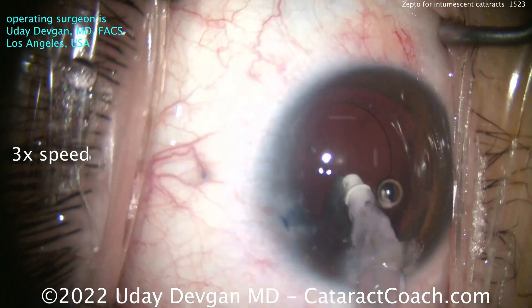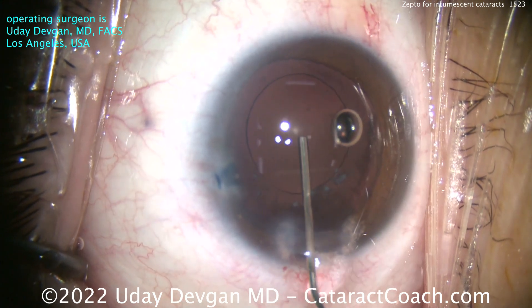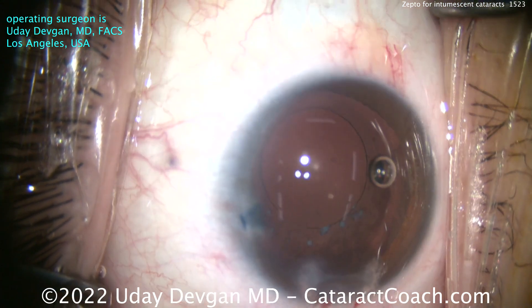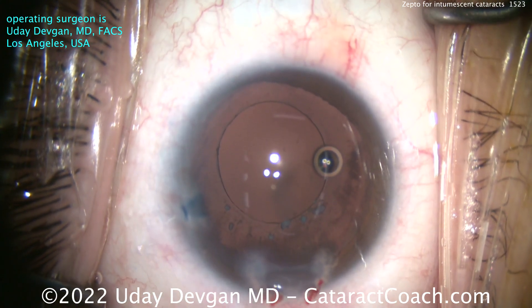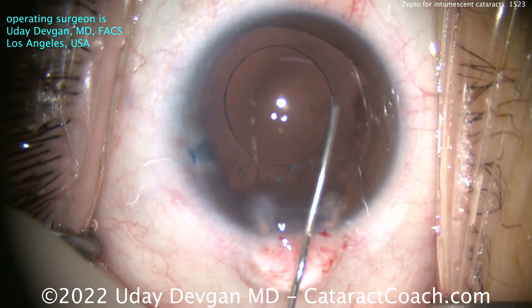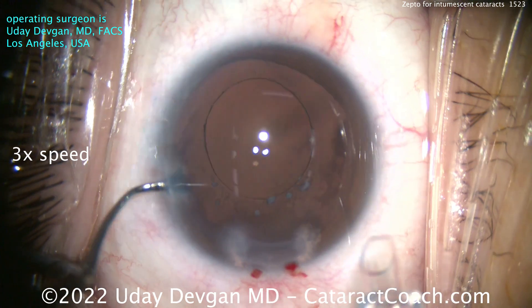You can see here with the I/A probe cleaning up the capsular bag — it looks fantastic, and now we're ready for the lens. Back to normal speed. Look at that capsulotomy — beautifully centered. Look at the Purkinje image; I was able to center up this capsulotomy exactly where I wanted it. I want it beautifully centered because I want the optic of the IOL in the patient's visual axis, and that is always guided by the Purkinje images.